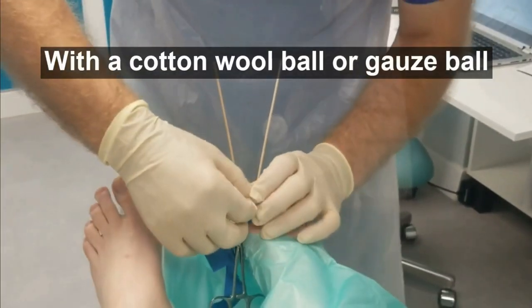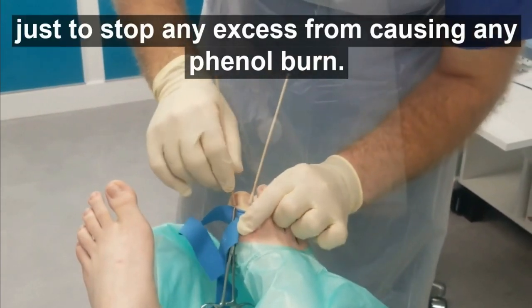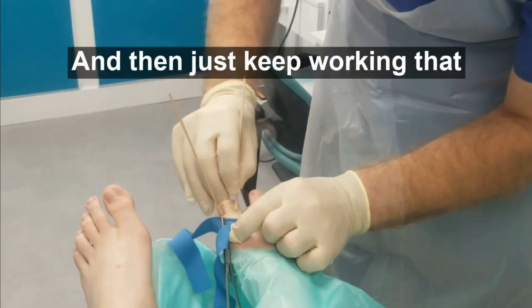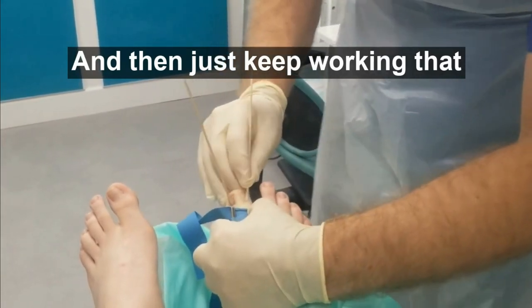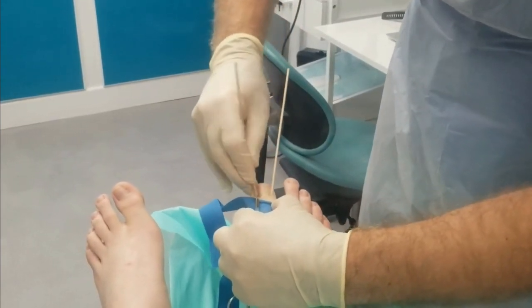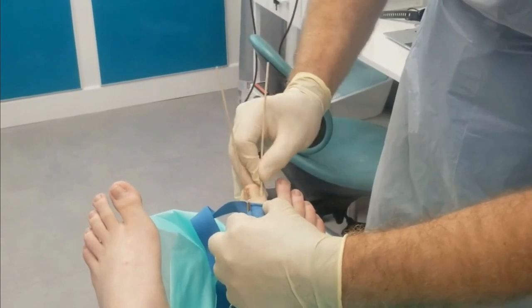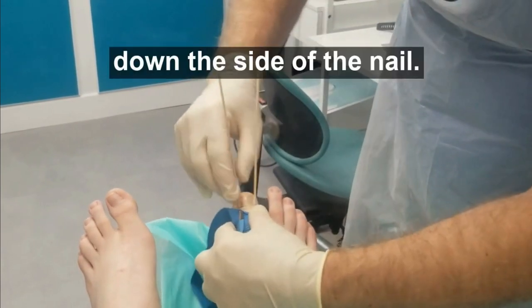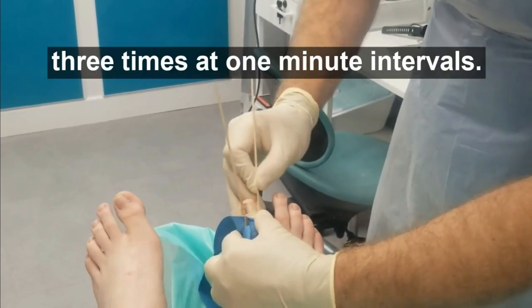Get some cotton wool ball or gauze ball just to stop any excess phenol from causing phenol burns, and then just keep working that down the side of the nail. We're going to repeat this three times at one-minute intervals.